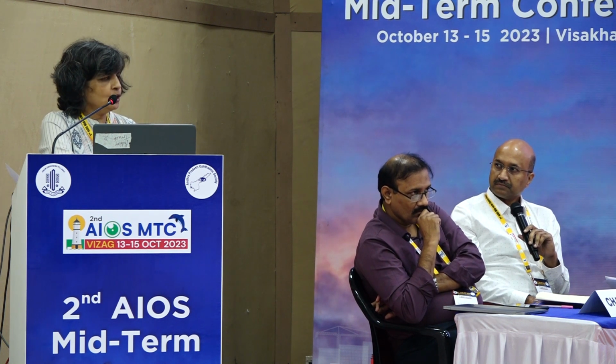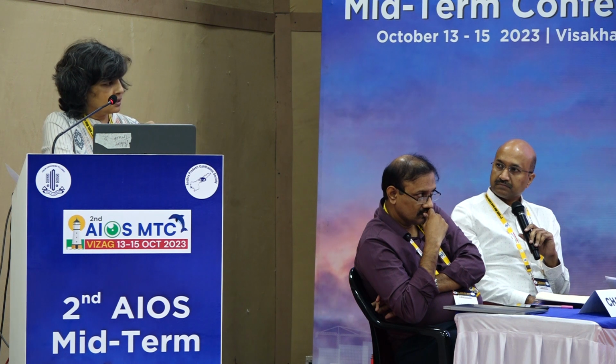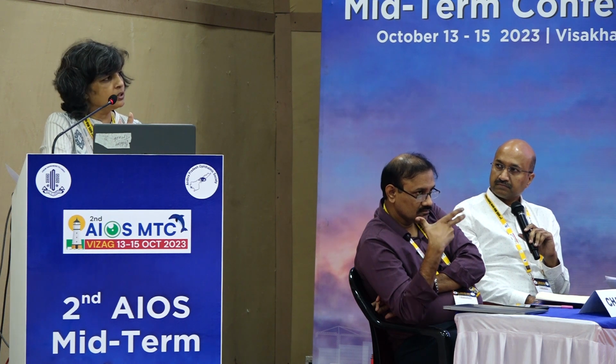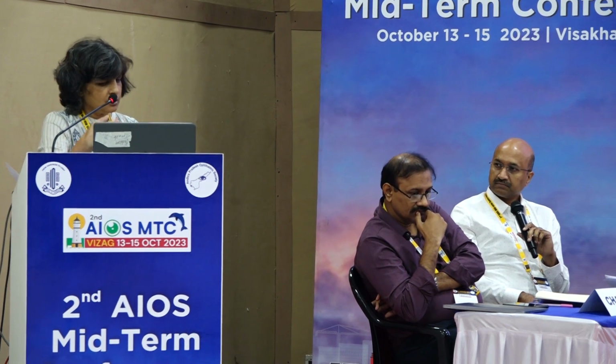So that's one. I use a 2 cc syringe because that gives more control than a 1 cc syringe. He uses a 2 cc syringe and not a 1 cc, because the tuberculin syringes are longer, so control is less. 2 cc is smaller. I've not had a problem of lack of control. You just try it out even outside.